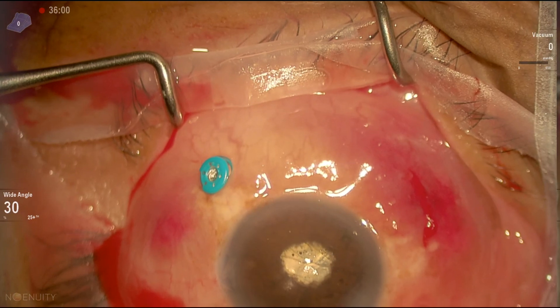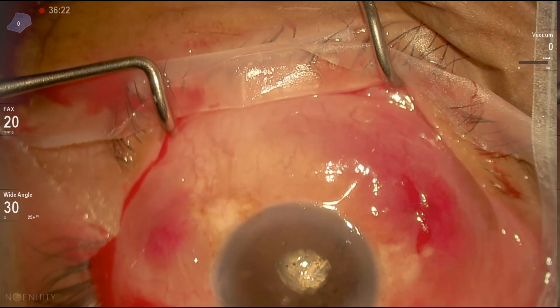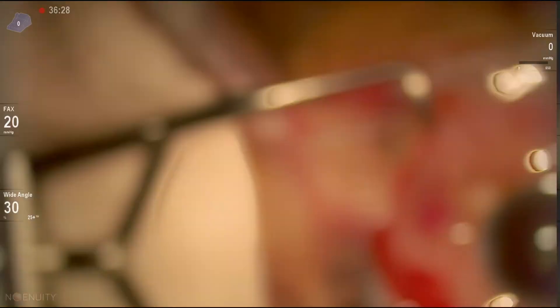Then we remove the infusion cannula. In this case, we found the eye soft, so we put the infusion cannula back with the air on. Then we remove the trocar and the infusion cannula.